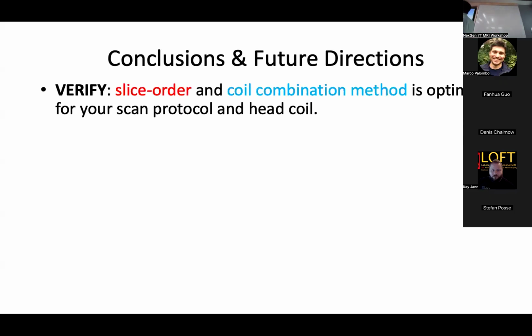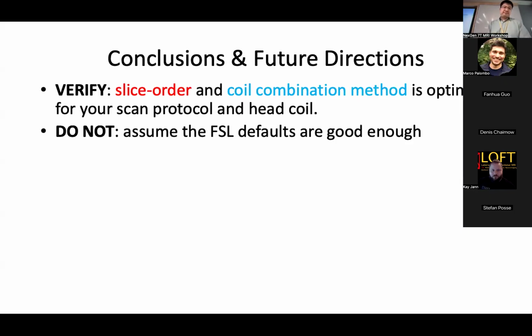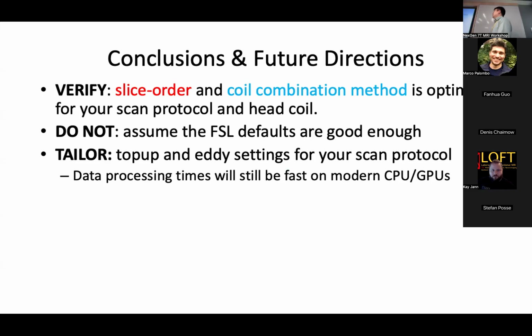Number one, verify your slice order and your coil combination. Make sure they're optimal for the scan protocol and the head coil that you're using. Don't assume the FSL defaults are good enough for your data set. Tailor your top-up and eddy current correction settings for your scan protocol.